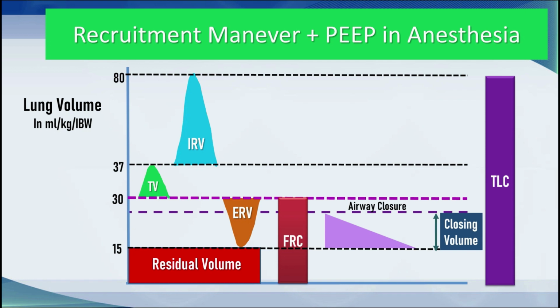As you can see here, lung volumes have been restored easily. You must keep in mind though that these are normal lungs. As a consequence, total lung capacity has been restored. During the operation though, these lung volumes may drift downwards, but assuming that you don't soak the lungs in fluid, they can be easily recruited again.